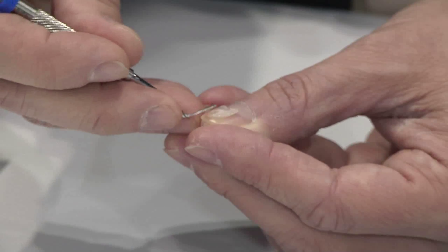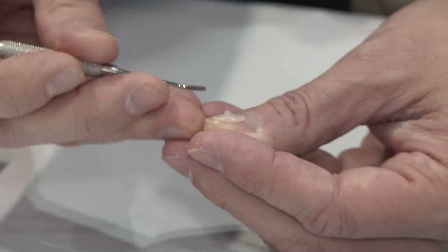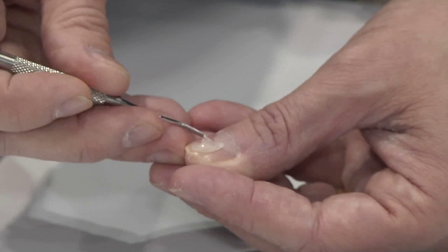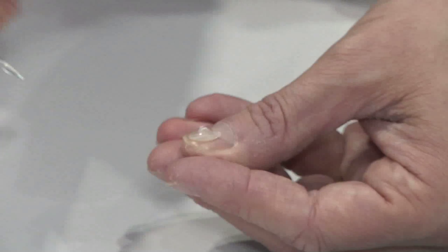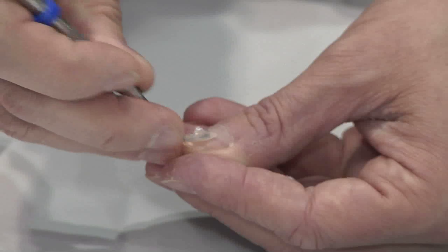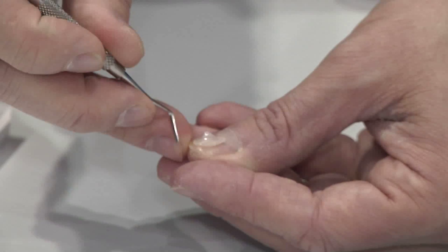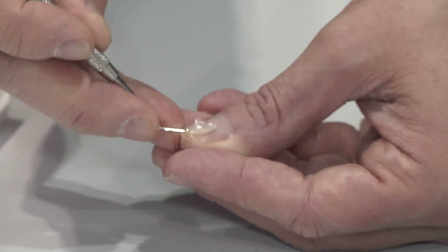You can thin out an enamel layer and show a little underlying dentin layer through. You can guide it down gently, but once you put it where you want it, it stays — you don't see this material want to slump or come off in any way. It allows you to set it up and get it where you want it, so that when you're curing it, you cure it with a minimal amount of finishing because most of the finishing has already been done due to the handling characteristics of the composite.